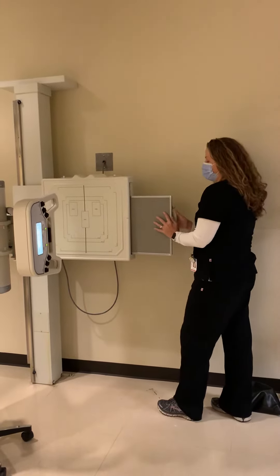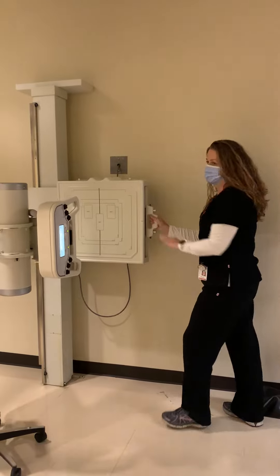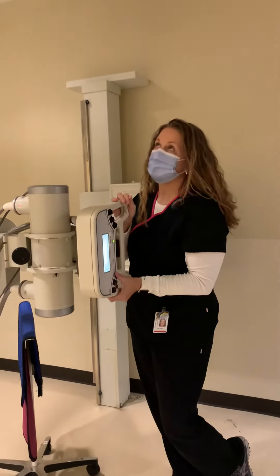Today, your technologist is going to demonstrate AP AC joints, with and without weights.